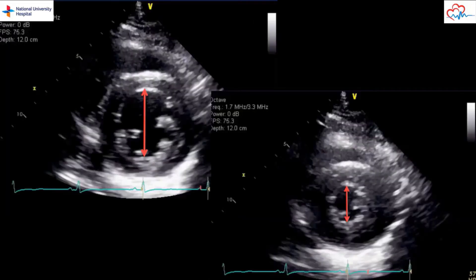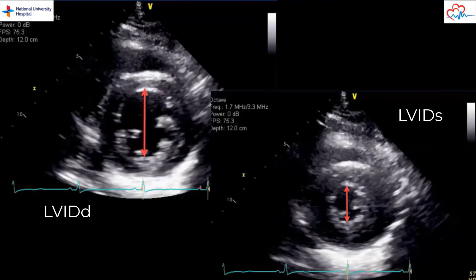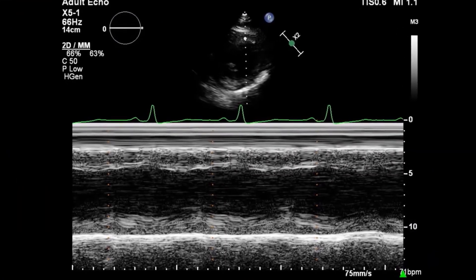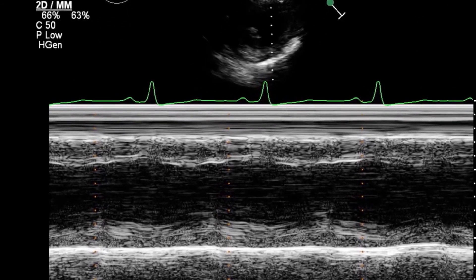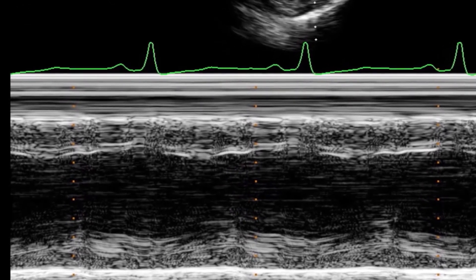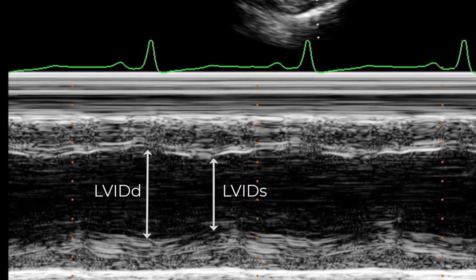Here we have the same measurements of LV diameter being made in the parasternal short axis view. The image on the left shows diastole, while that on the right shows systole. We can also obtain these measurements with M-mode, either in the parasternal long axis or parasternal short axis view as shown here. LV ID diastole can be measured at the R wave of the ECG, while LV ID systole can be measured where the LV cavity appears smallest.